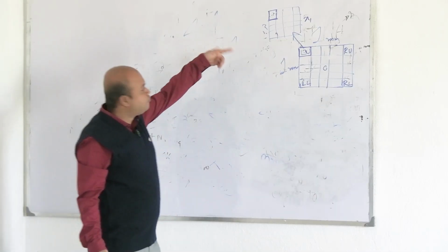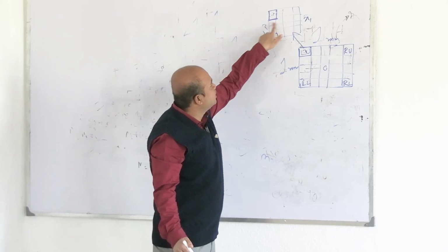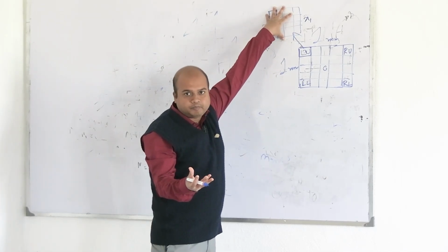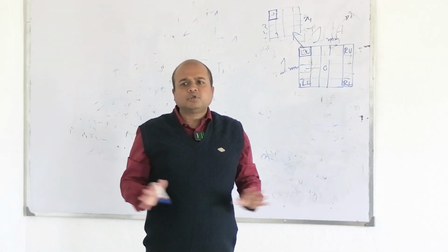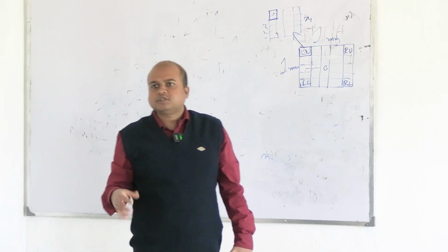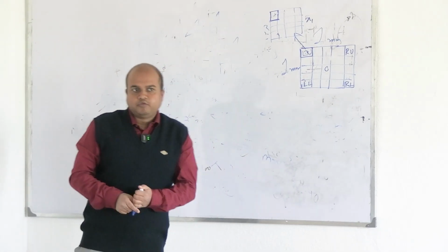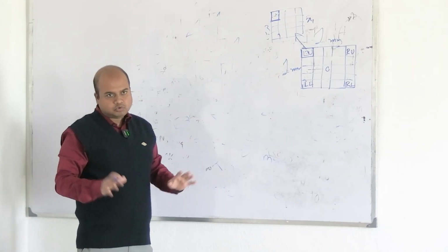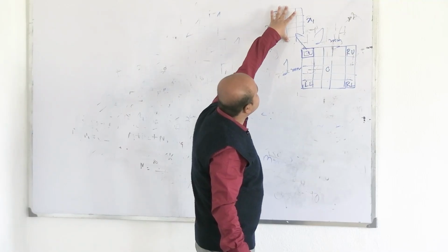We start from left upper and end counting those 16, 4, then 4, and this should be focused under a single field. That is why we use 40x. It is possible to take a single field under 40x, because the more the magnification, the less the field area. If you do it at 100x, it will reduce. If you do it at 10x, then it will be more. So, by taking 40x or 45x, it is a single field.